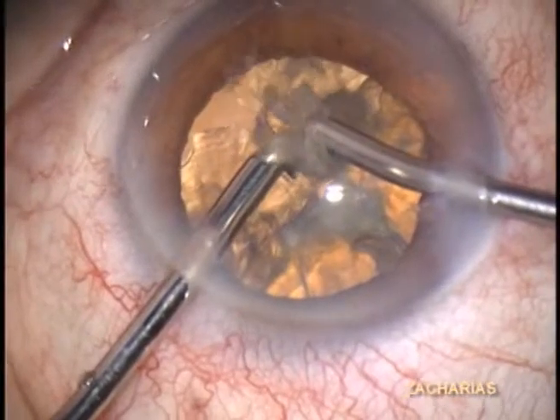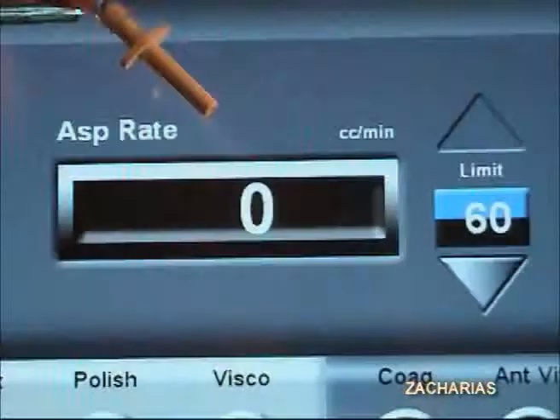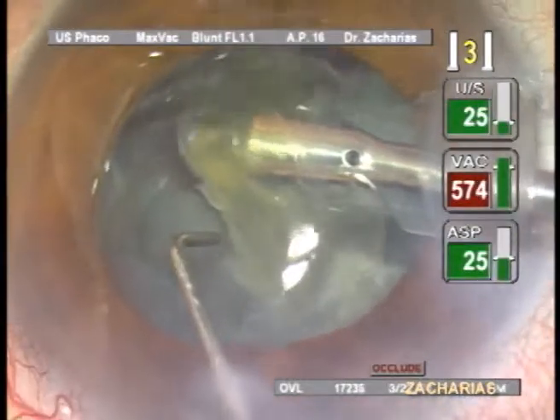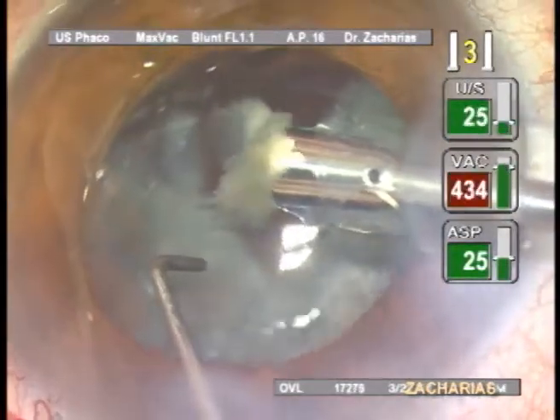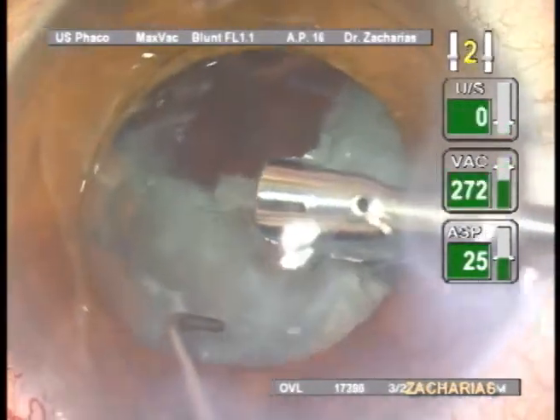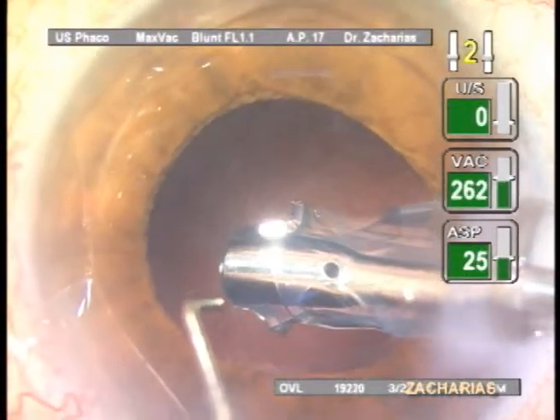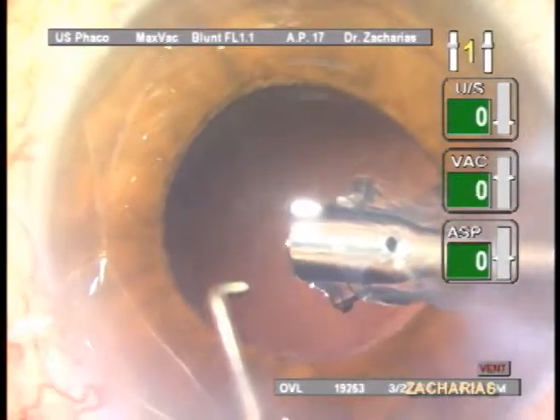An active fluidic balance concept for MICS based on positive pressure generated by the aspiration pump is presented. A phaco probe concept having a blunt tip covered by an elastomer membrane is shown effective to remove even hard cataracts. At the same time, this probe is capsule-friendly, being ideal for phaco-refractive procedures using standard ultrasonic equipment.